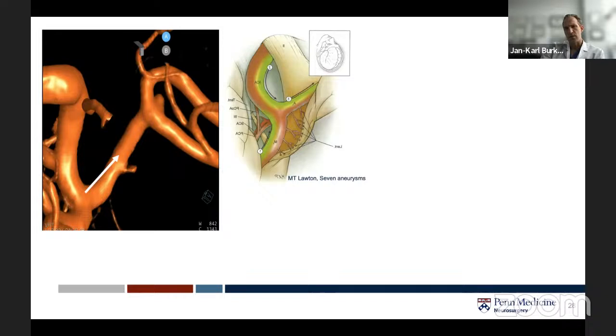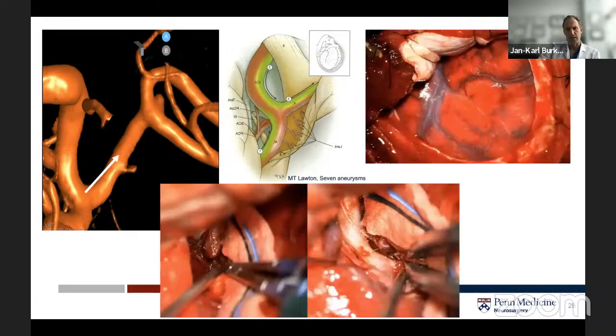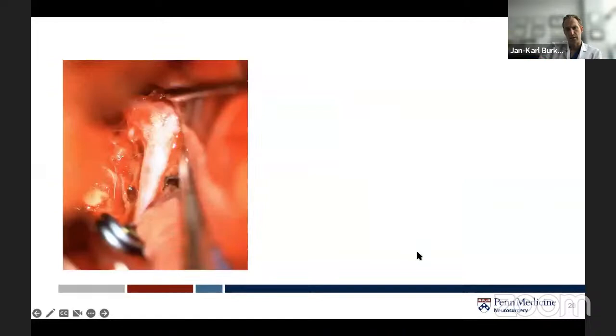Here in this scenario, as you can see, the aneurysm is pretty hidden. Obviously, you could come from the contralateral side, but then you hit the dome of the aneurysm right away, and you may see the A1 for proximal temporary clipping quite late. So I usually come from that side, and it was fairly swollen here after arachnoid dissection. We got a lot of space, and you can see here the beginning of the A1 dissecting down, and that was kind of the view of the A1. Here's the aneurysm now pointing away from us. There's already a temporary clip on the A1.